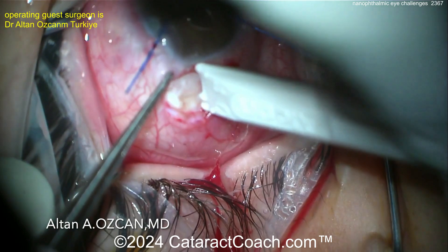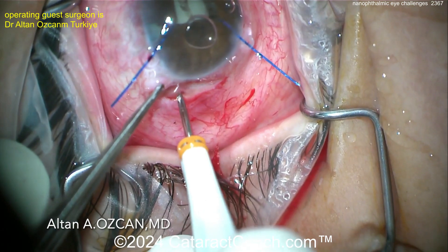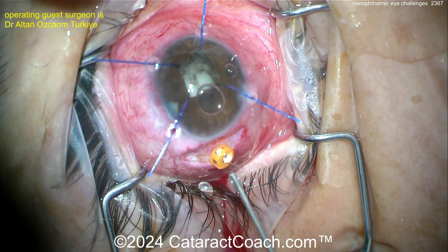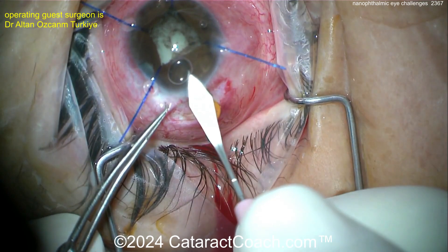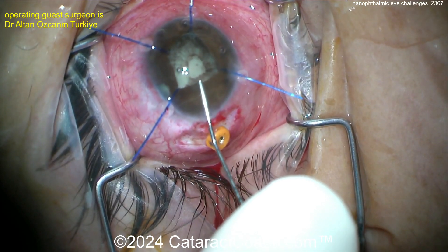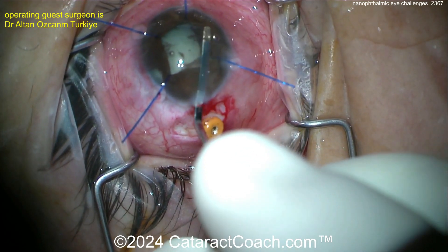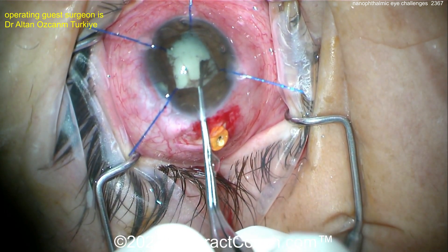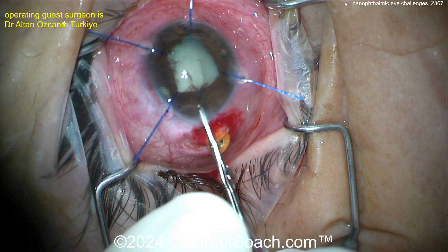Now the catch: in a 15-millimeter axial length eye, where exactly is pars plana? You have to make sure you're not going into peripheral retina. Look at the entry site post-op or immediately on the OR table and confirm there are no entry site breaks. After doing a little bit of vitrectomy — just a couple seconds' worth — put more viscoelastic in the AC, then a little more vitrectomy, back and forth. Do that until you have the correct AC depth. If you do too much anterior vitrectomy at once, you'll get too deep of an anterior chamber.